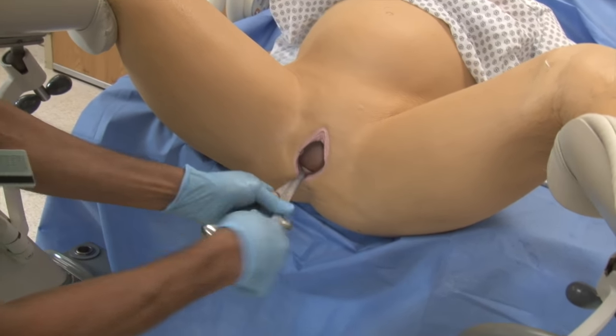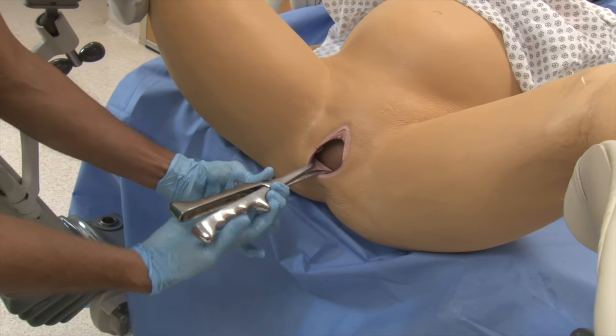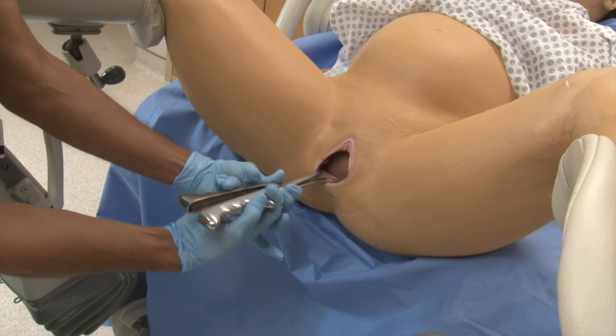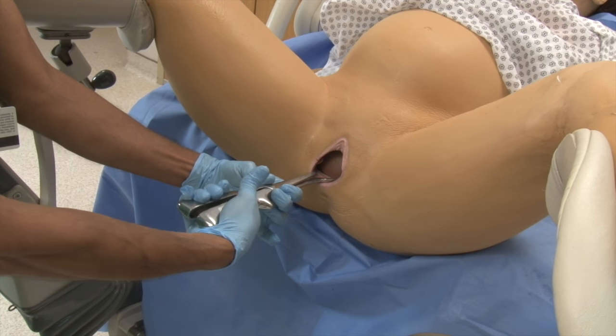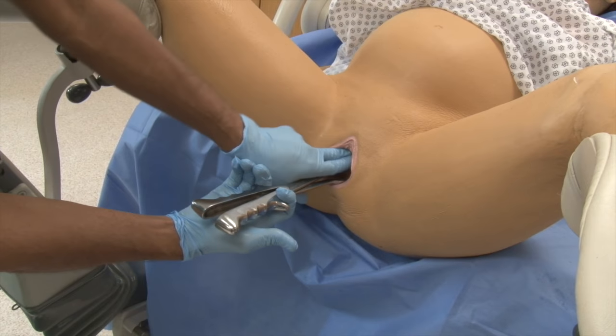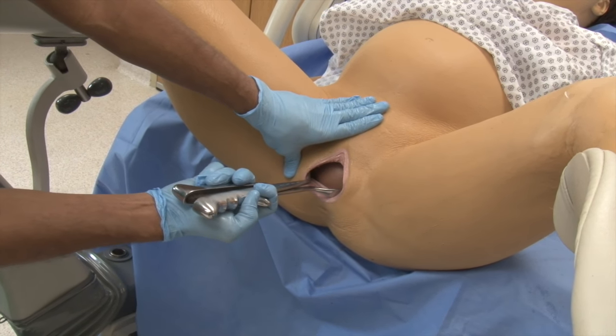After application, you can check the blades to make sure they are in proper place, then close the blades. The force of delivery is going to come from your hands — your right hand, if you're right-handed, under the actual blade handles. Instead of squeezing the handles, you want to keep it under. My left hand is going to be either feeling the head or keeping it on mom's symphysis, and then you will pull and traction the baby horizontally.